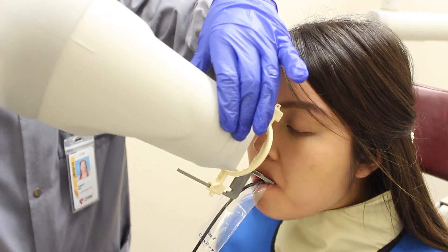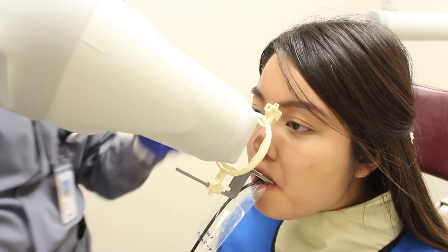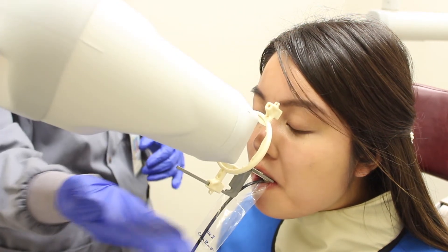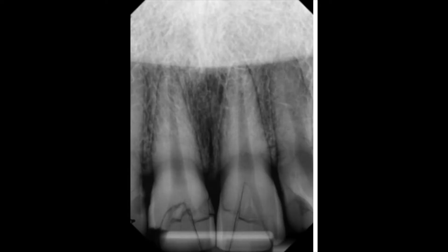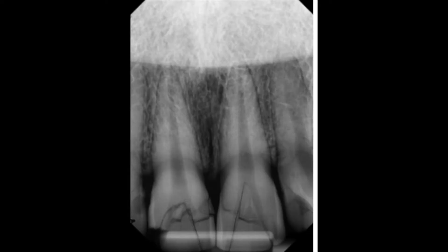That means there was no radiation being exposed to that portion of the sensor, which is why we got a radio opaque or white area on this image. In order to fix this, you need to realign the tube head with the aiming ring and make it parallel with the indicator arm. As a recap, this is what your anterior maxillary central PA should look like.